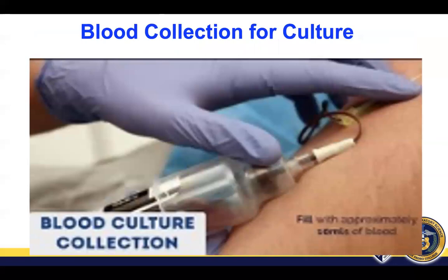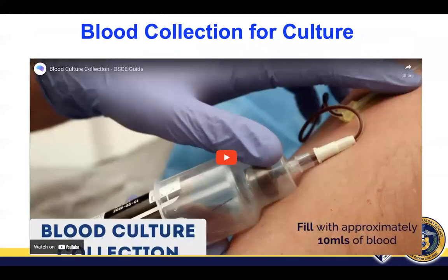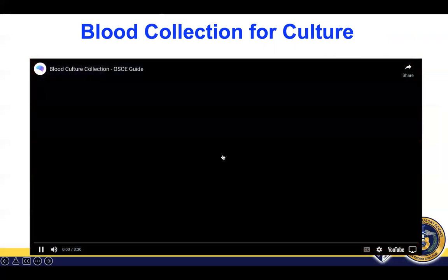Okay, so this is where we get to watch a video on how blood culture collection is done. Allow me to show you.